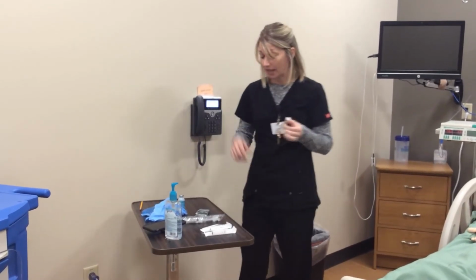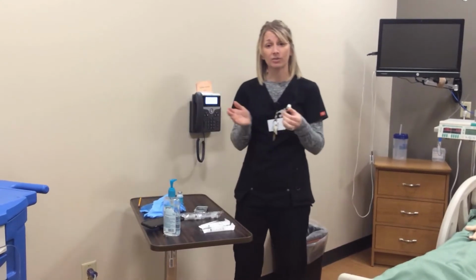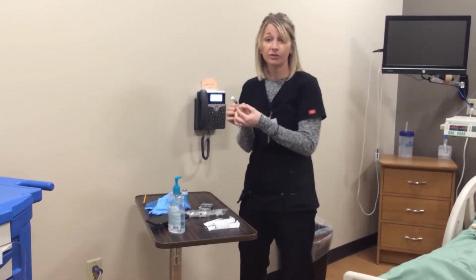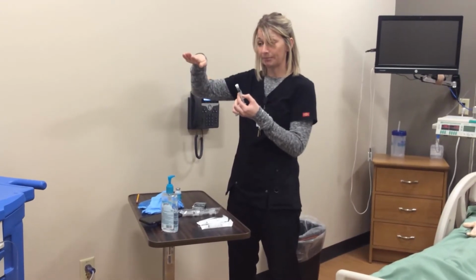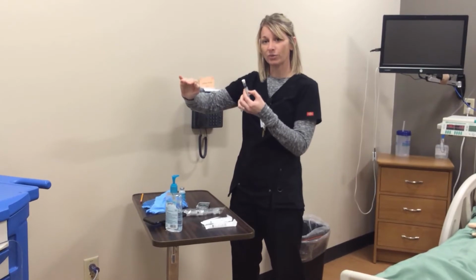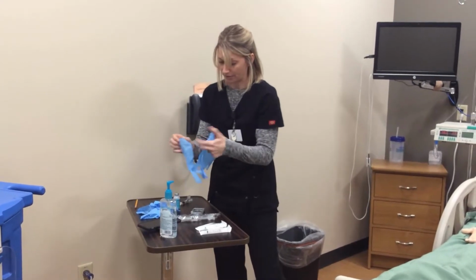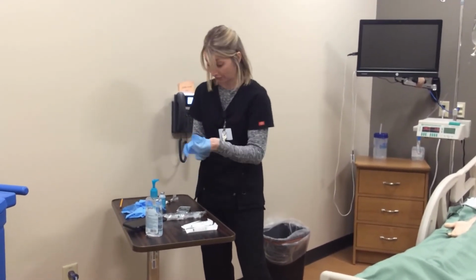So what I would do is find another RN on the unit and ask them to come with me to the Pyxis. We pull the medication up and we document that I'm going to give 2 milligrams versus the 4 milligrams. Then it brings up another little box where you put the amount that you're going to waste. While that other RN is there with me, I am going to waste the medication in front of her.